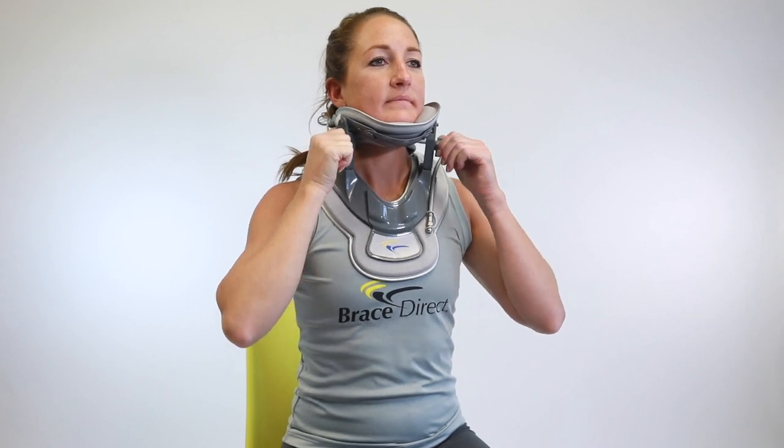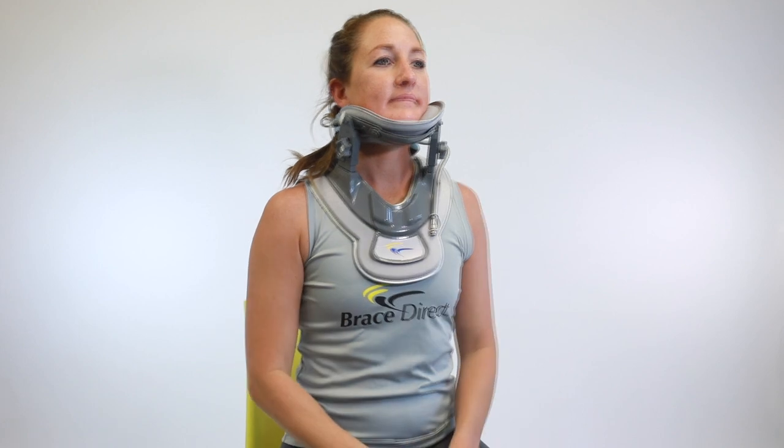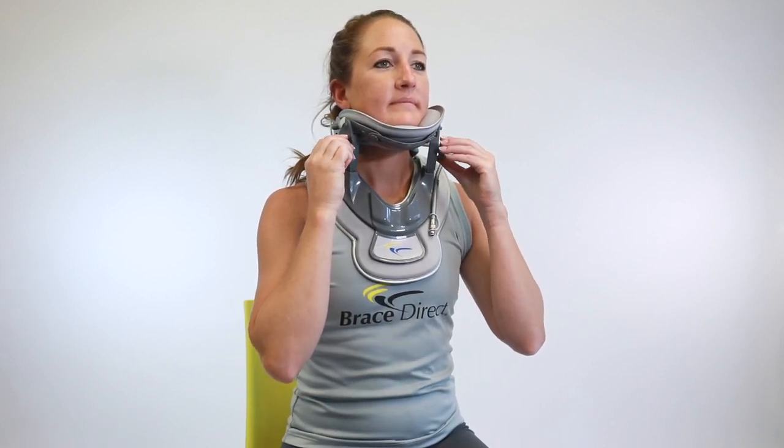Turn the side knobs upwards for the desired level of traction. Turn the knobs down to lessen the traction.